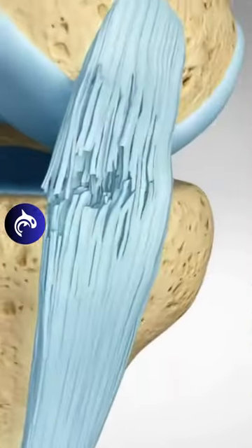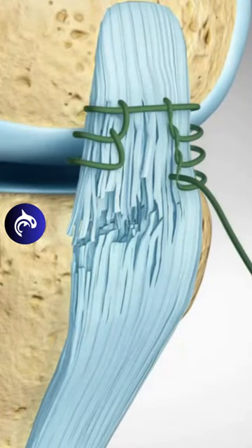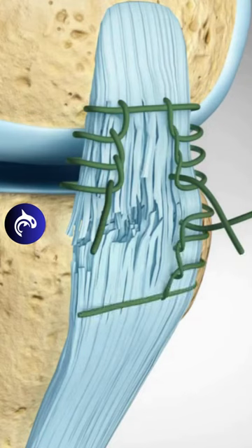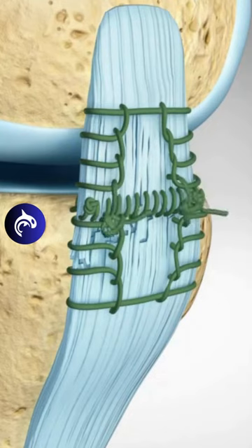Due to a good blood supply to the MCL, the torn ligament can be repaired and heal. The surgeon will reattach the MCL, sewing the torn ends together. Full recovery may take up to a year.